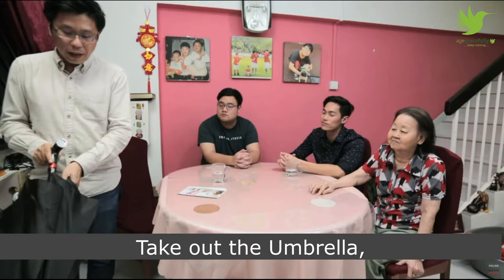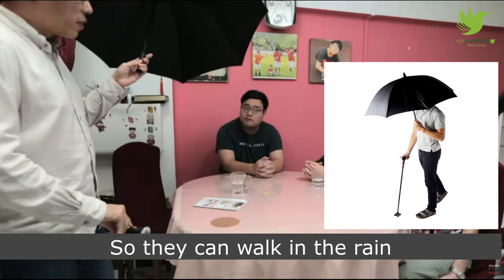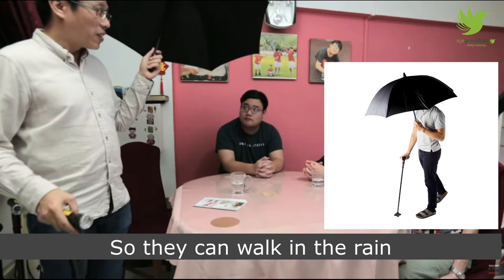If it really rains, you can remove the walking stick from the rubber teeth, take out the umbrella just like a normal umbrella, and then retrieve the walking stick from here and reinsert it back into the rubber teeth, so they can walk even in the rain.